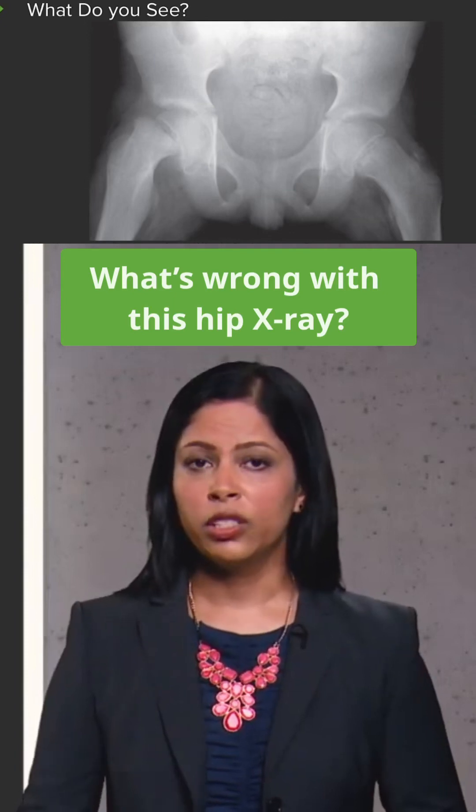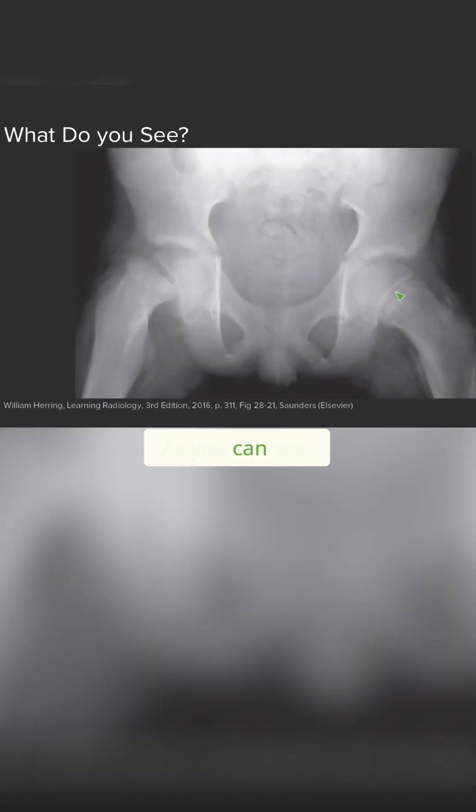This is an x-ray of the pelvis. This is also a skeletally immature patient. As you can see, the growth plates are open right here on the hips. You can see the other growth plate right here.